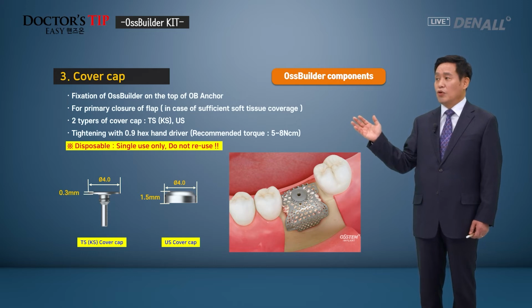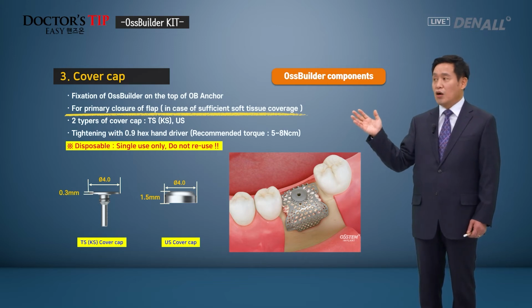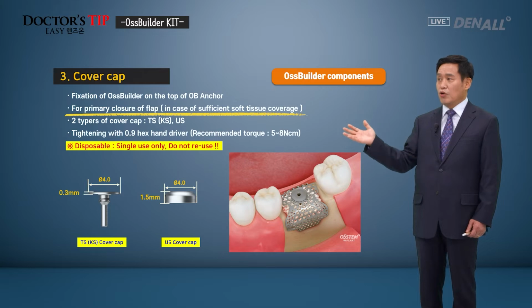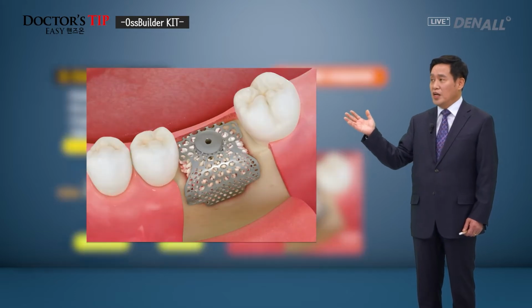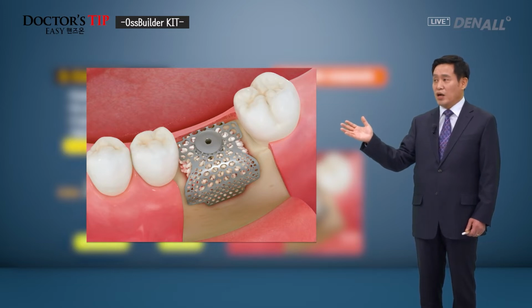Next is a cover cap. In my case, when I use OssBuilder, the principle I use is primary closure when I do GBR, so I use cover cap most frequently. I use this for GBR when we get primary closure. In other words, when I can close without tension sufficiently, I use cover cap. When there is sufficient soft tissue coverage, if you do accurate periosteal releasing incision, you'd be able to get primary closure without tension, and in those cases, you can use cover cap.